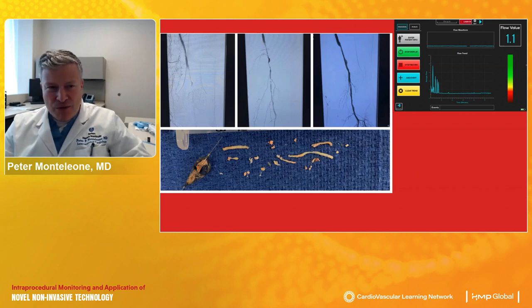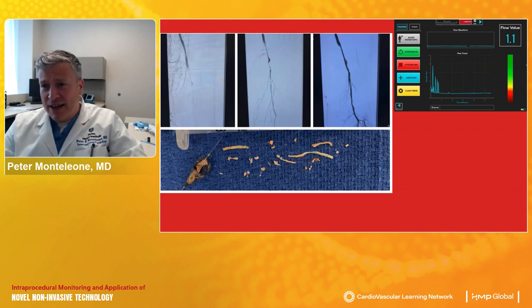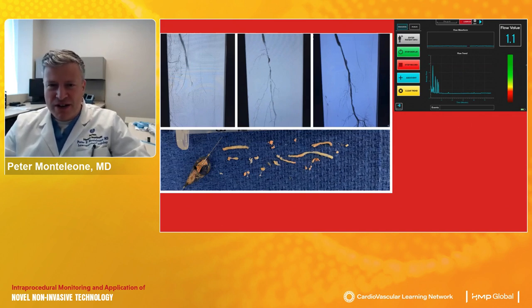Initially the thought was, well, is this an acute thrombotic limb in the popliteal segment? This is someone whose family member actually drove them from their other hospital to Central Texas, where we met them when they were first brought in after they were told they were going to lose their leg. They had severe acute limb ischemia on top of non-further revascularizable limb ischemia, and they started with a flow value of nothing on the toe. We thought initially this would be thrombus and we'd be able to pass thrombectomy devices and lysis catheters into that area, remove the thrombus and have a nice result.